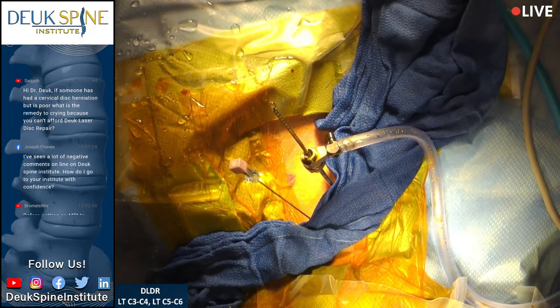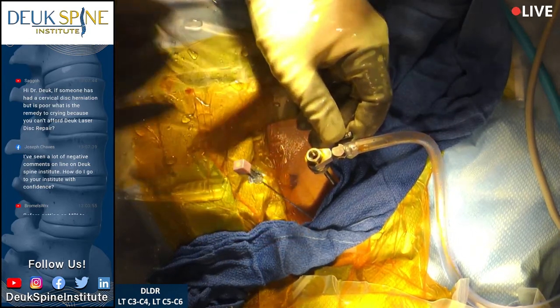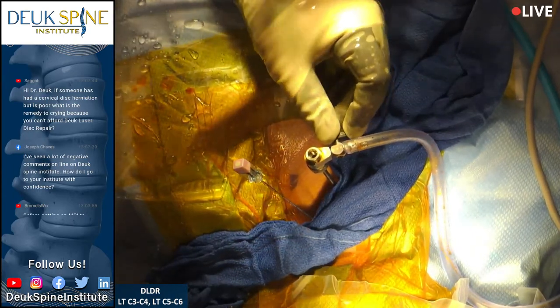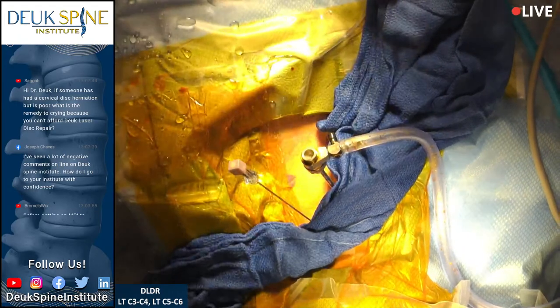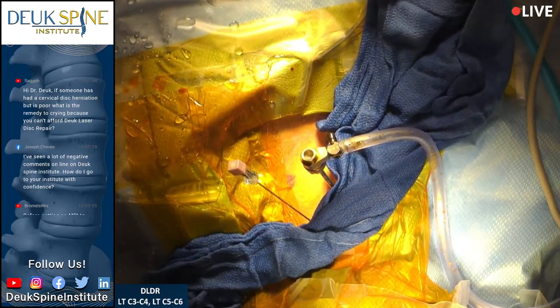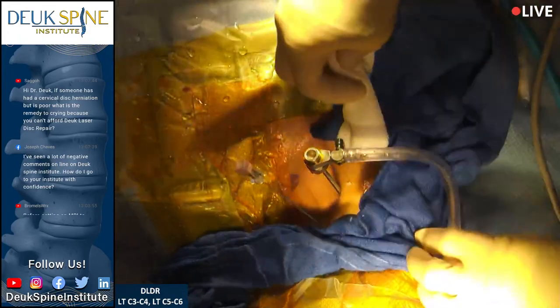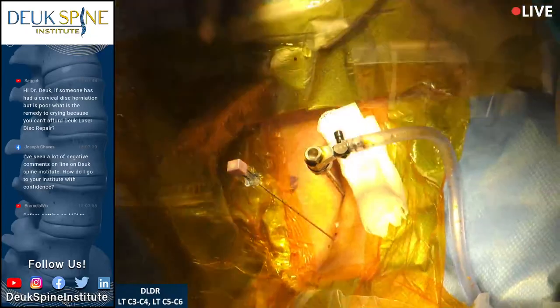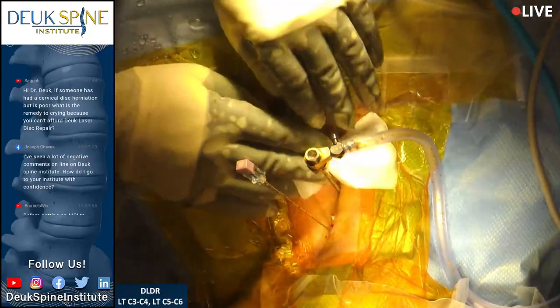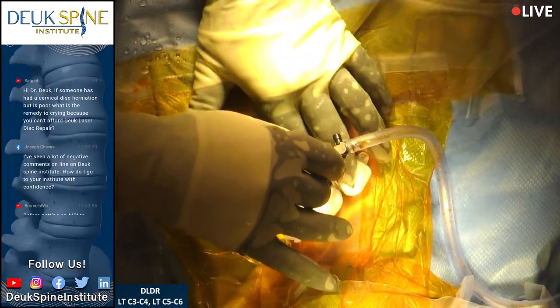We're going to move on to the next disc. I'm going to remove this tube. You can see the liquid I put in is not getting pushed out anymore — the pressure in the disc is gone. We've taken care of it, and that's going to mean a lot to him in terms of recovery.